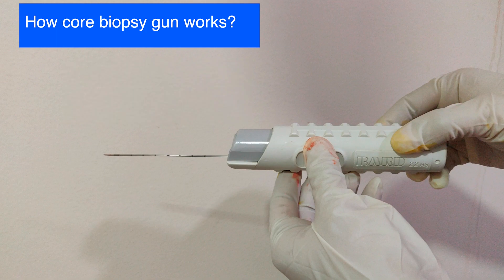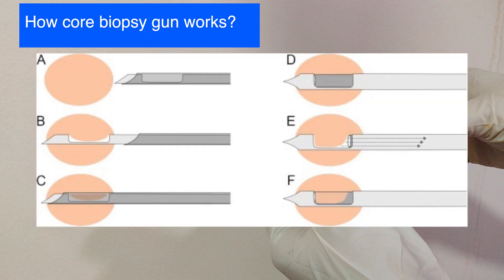When we fire this core biopsy gun, the inner stylet travels first into the tissue, and a part of the suspicious tissue sits inside this notch. Immediately after, the cutting cannula runs over this stylet to cut the tissue sitting in the notch away from the rest of the surrounding tissue. This is how a core is created.